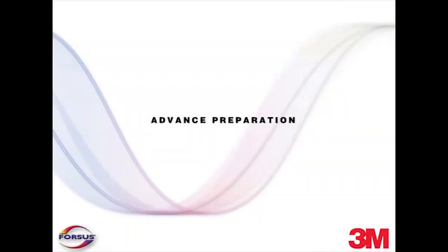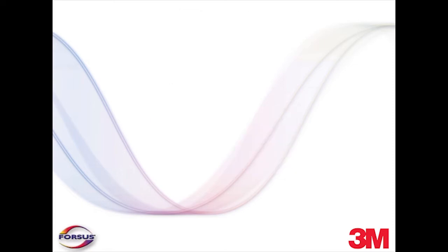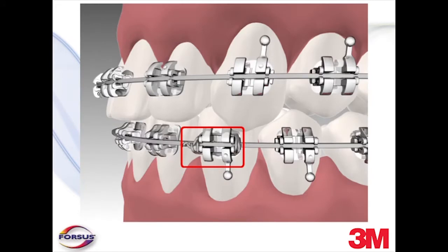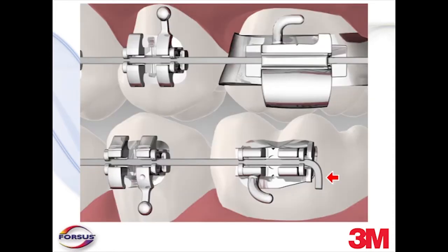Before installation, there are some general clinical requirements for the Forces Fatigue-Resistant Device. It is important to take the following initial steps to control desired movement of the complete mandibular arch. First, use either a 17 by 25 stainless steel arch wire or a 19 by 25 stainless steel arch wire depending on your particular slot size. Second, ligate the lower brackets where the pushrod will rest with stainless steel ligatures. This will prevent unwanted rotation of the teeth supporting the appliance's force. Third, the lower arch wire should be securely cinched to control anchorage and mesial flaring of the lower arch.